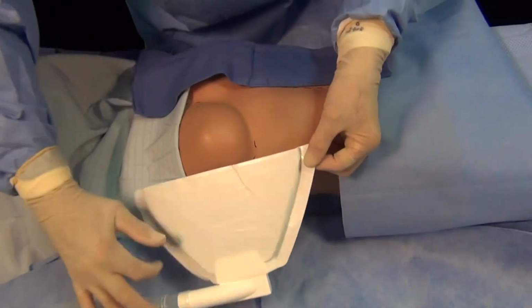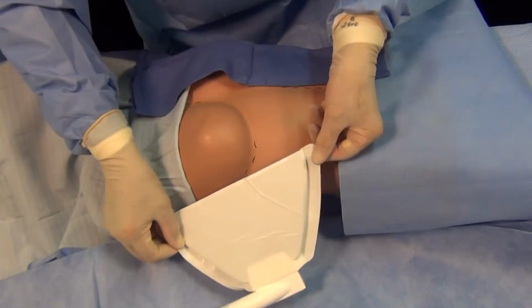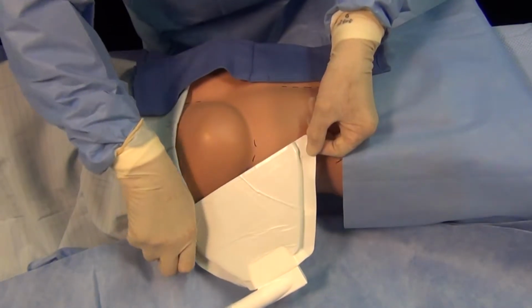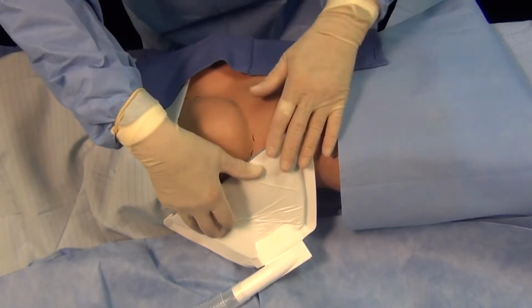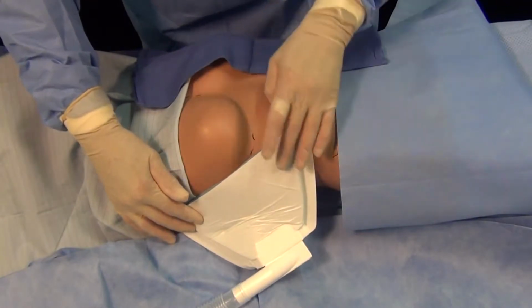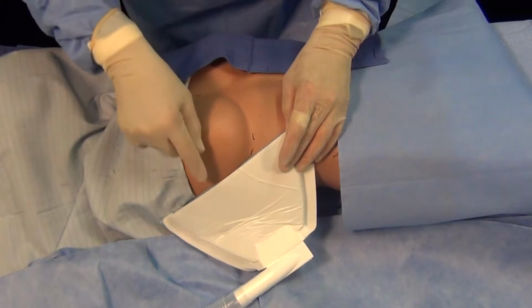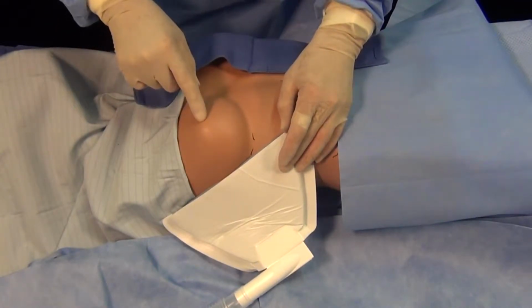What you cannot do is put this over the breast so that it will interfere with the surgeon's ability to feel the skin flap and the thickness of the skin flap. Therefore, the best you can do is to put it along the inframammary fold of the breast up toward the axilla. The incision will be over on the breast side, right on top, centering around the nipple.